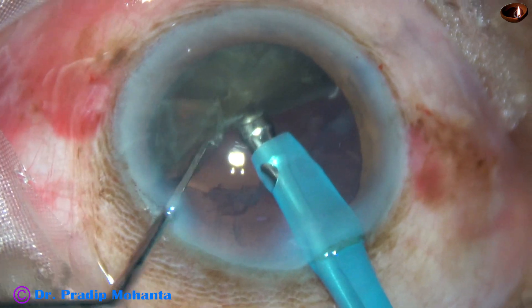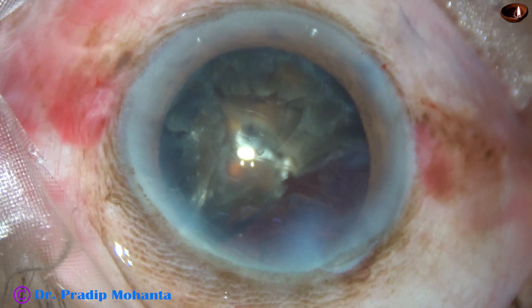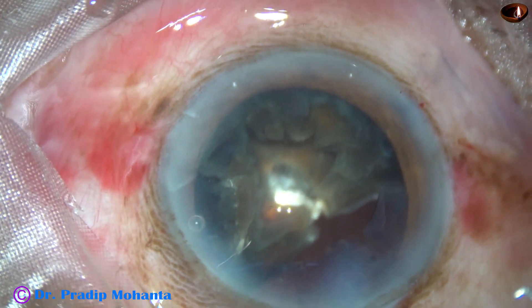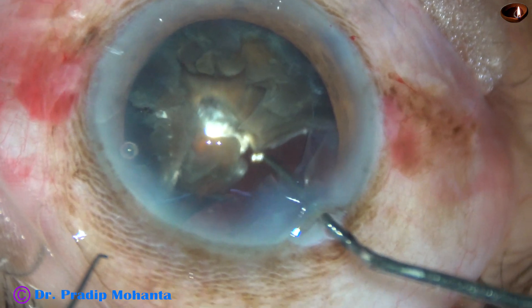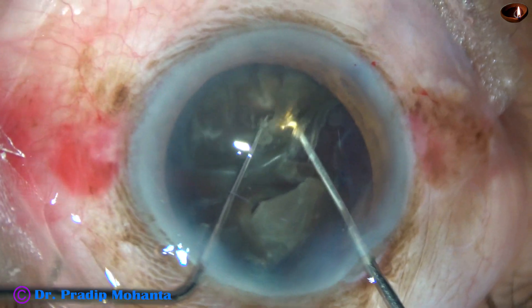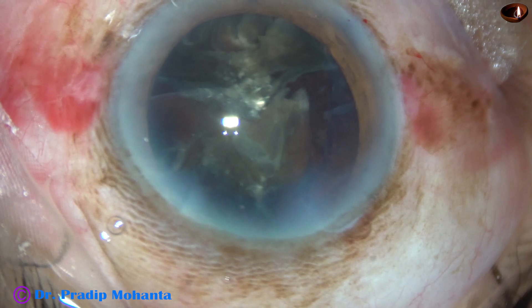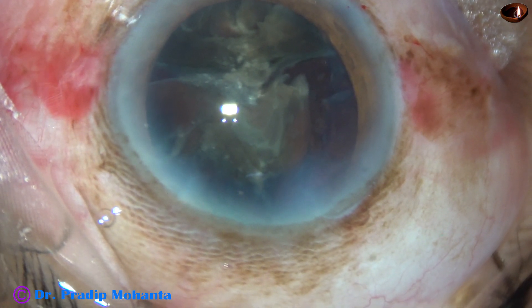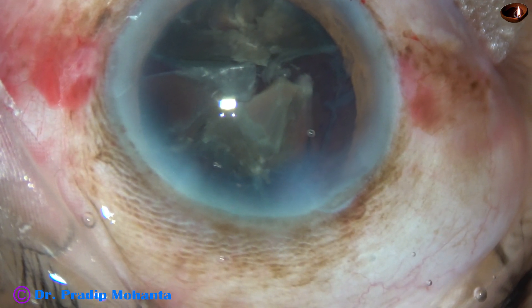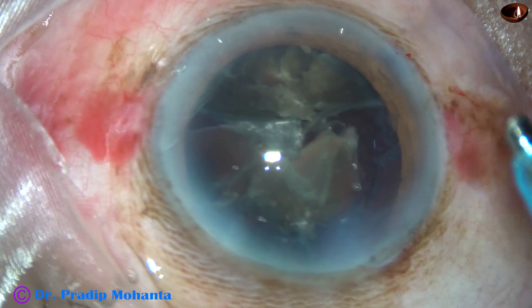With my blunt chopper I lift a piece and apply a burst of ultrasonic energy. Now I come out and want to manually separate the pieces. I inject viscoelastic to push the posterior capsule back. The blunt chopper goes behind and the Sinskey hook in front, and I divide the nucleus in this way. I inject viscoelastic again to protect the corneal endothelium, and now I go again with the handpiece.